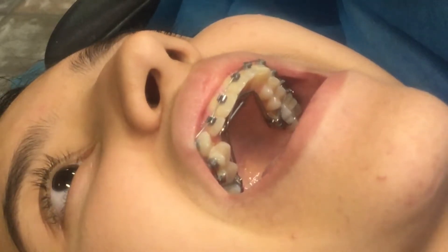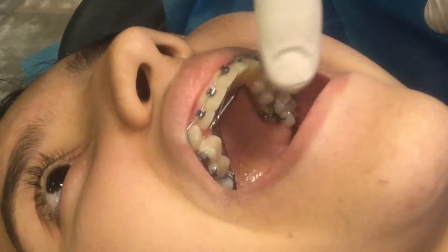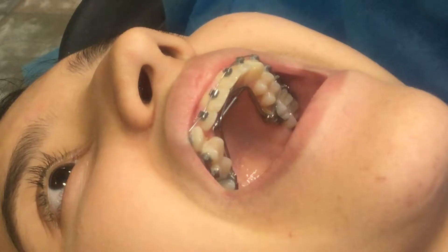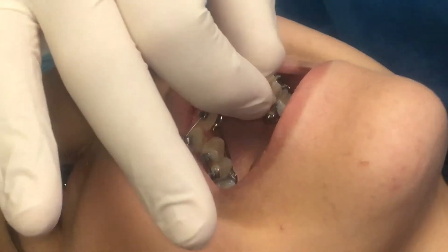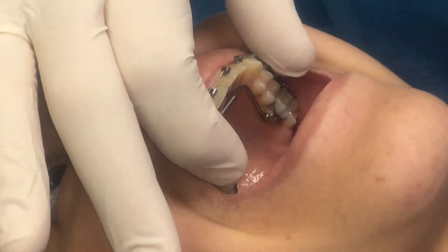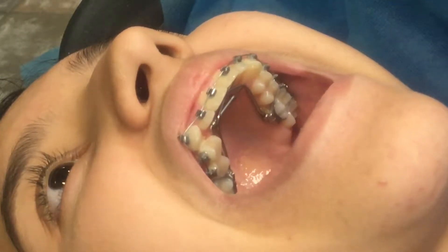Hey, this is Dr. Dyer again. You may remember from last time with the palatal expander — she's had this on for a month now and you can see it's already taken effect. The wires have pulled the teeth down some and the palatal expander is pushing out a little bit. It's only been a month so we're not expecting huge changes yet.